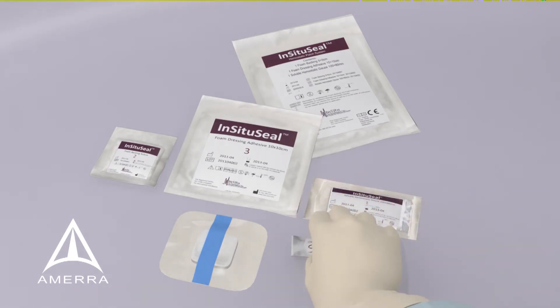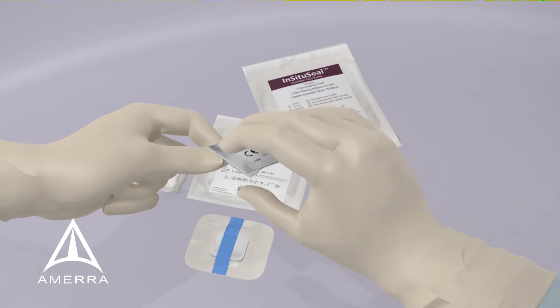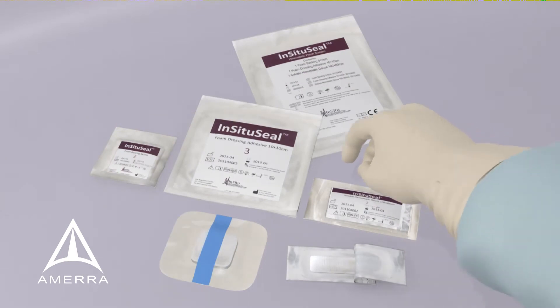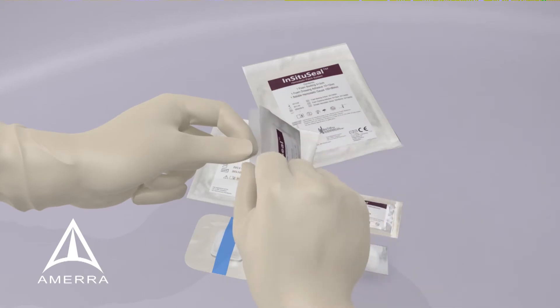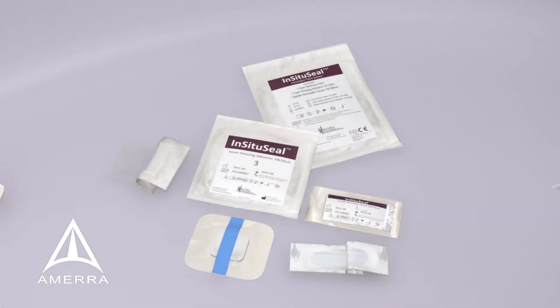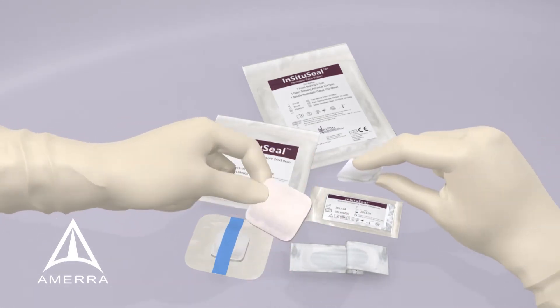Begin by opening piece one, the hemostatic gauze. Next, open piece two, the foam backing. Place the hemostatic gauze onto the white side of the foam backing.